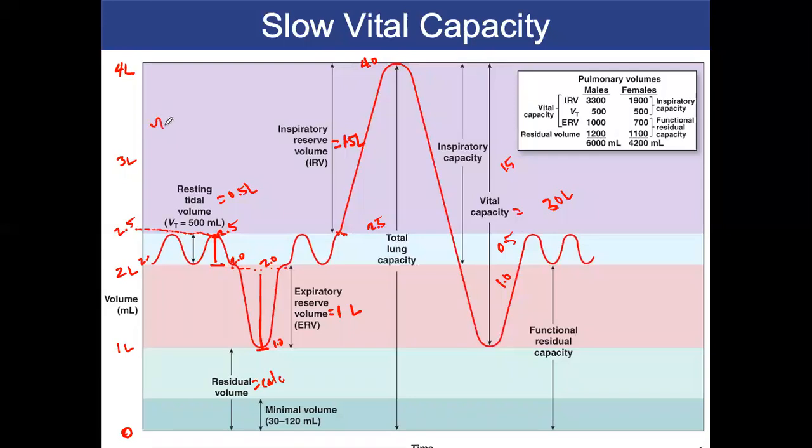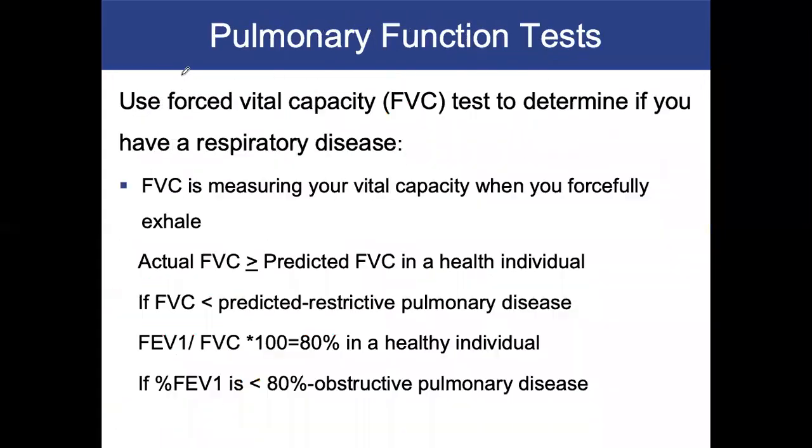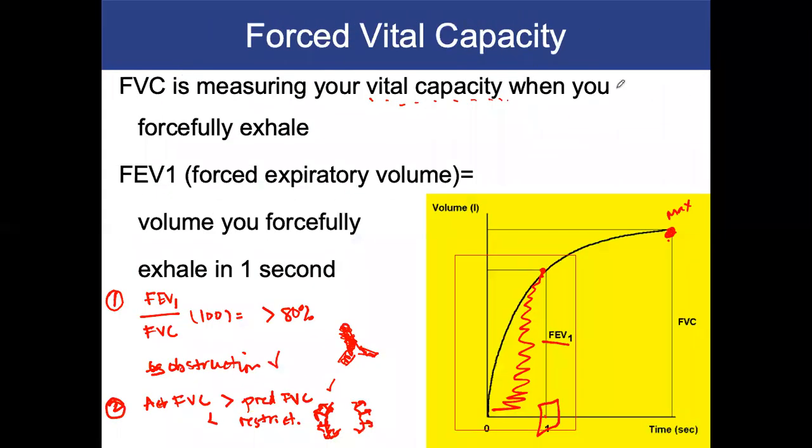Normally, this is your tidal volume, inhaling, exhaling, right? But with some waveforms, they do it differently. So this is inhaling, that's exhaling, inhaling, and exhaling. Okay, so it's flipped, so be careful. Same thing with vital capacity, forced vital capacity. Normally you see it like this, but you can also see it like this. You can see it flipped. So you guys should be able to apply it regardless.